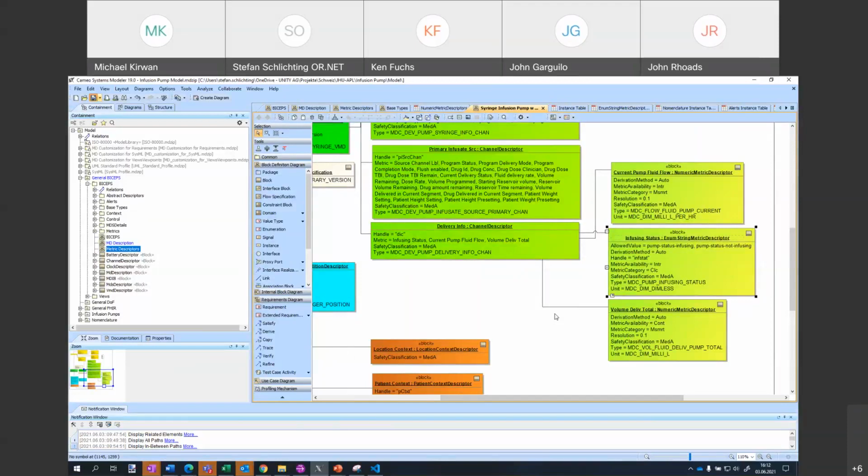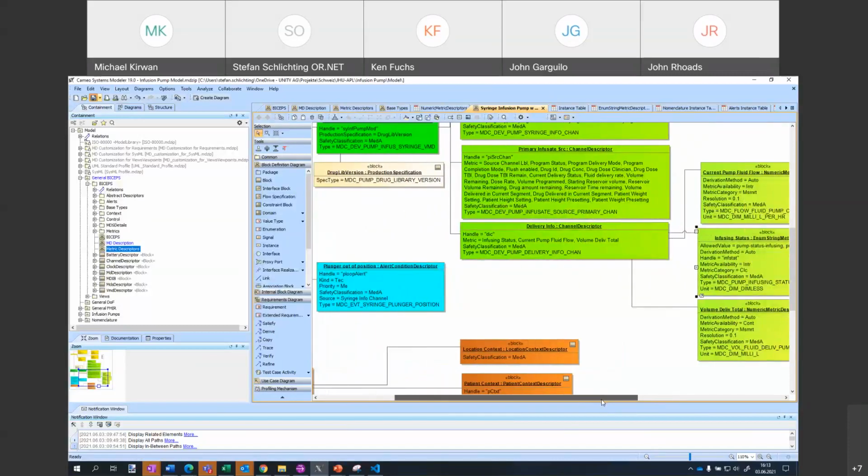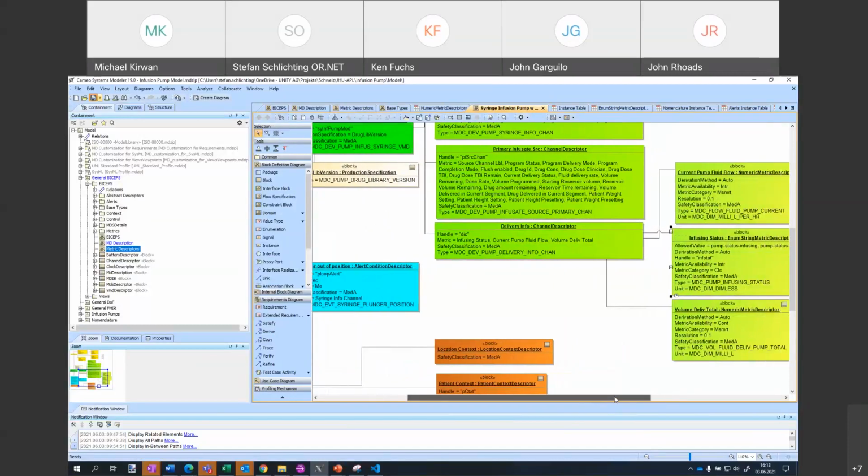If, for example, they can change at runtime, you can add in the module here a group of units, and then it will just have a group of units in there. Okay, so you could put sets there. Yeah. But for later generation, for a tool like an SDC simulator, you would have to pick one, because at runtime it can have only one. It can change, of course, but it can have only one.